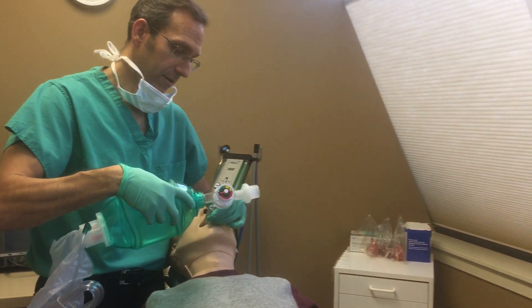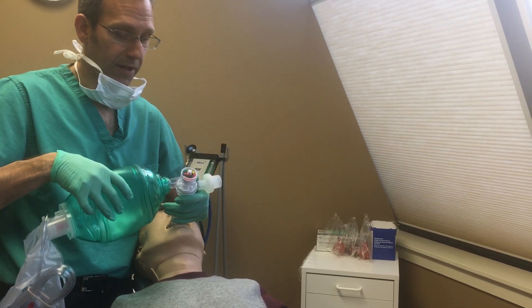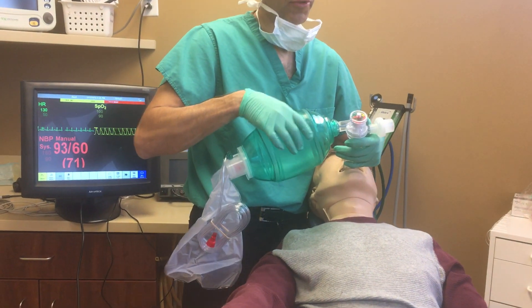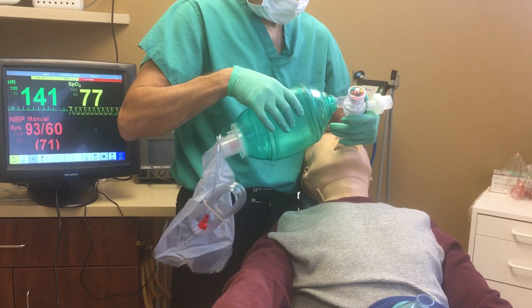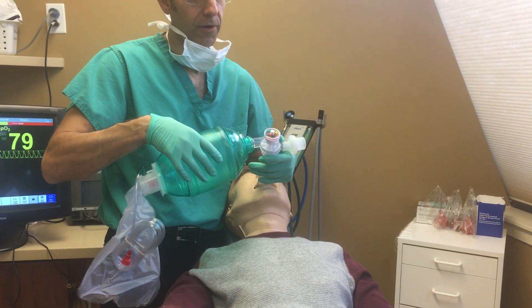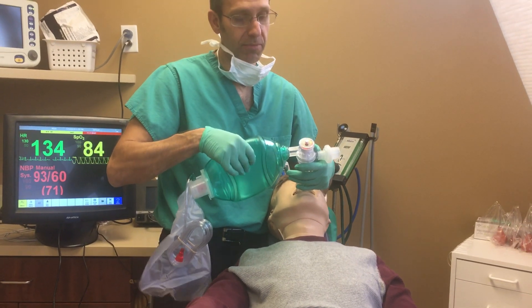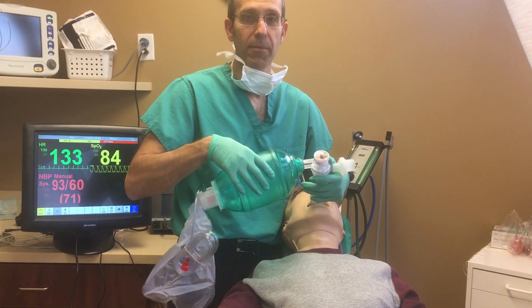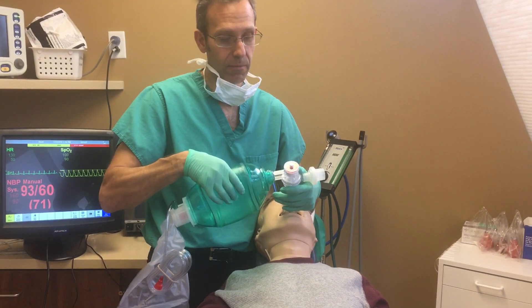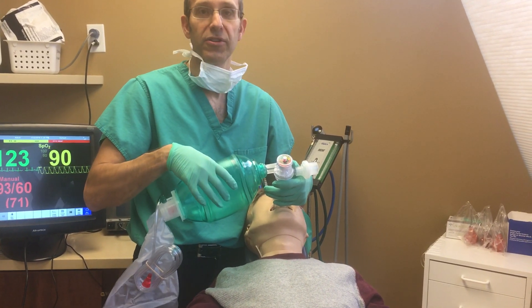Get my bag mask ready. Attempt to ventilate and I see chest rise. Notice we're still in the safe zone with our bag mask ventilation at about 20 to 40 centimeters of water pressure — safe so that we're not going to have any barotrauma. We notice we're getting chest rise, our oxygen saturation is improving, and our situation is managed.